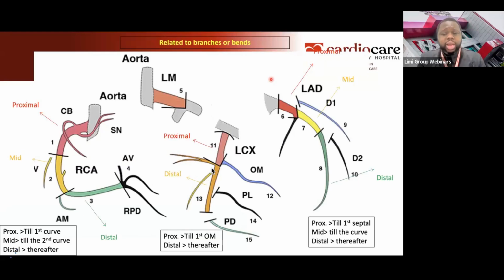Somebody says, is coronary angiography a mainstay for diagnosis or more of a therapeutic intervention? Also, is coronary angiography sufficient? Is CT coronary sufficient in diagnosis? So CT has its limitations. It is not the gold standard, and it typically will depend on the person reading it, and whether you have very good films, the quality of the machine, and whether you're able to slow down the heart rate. Even then, we've still had cases where the patient came with a normal result.